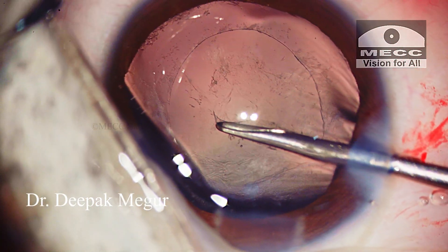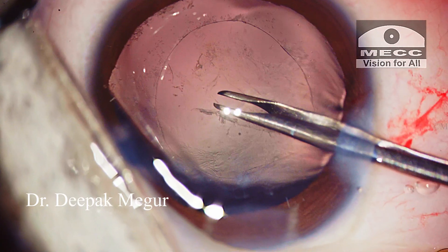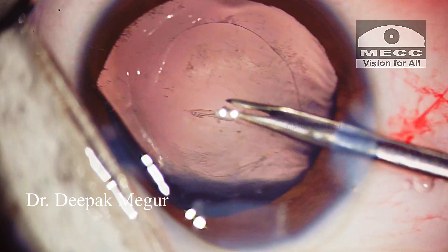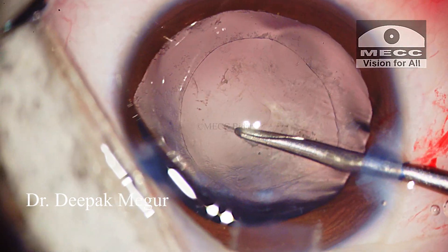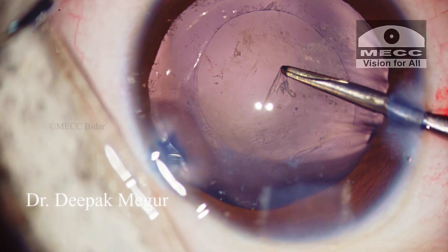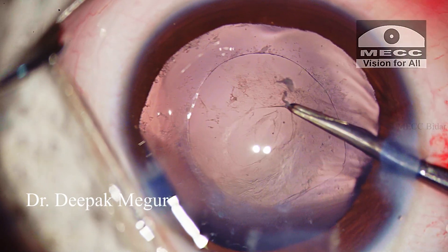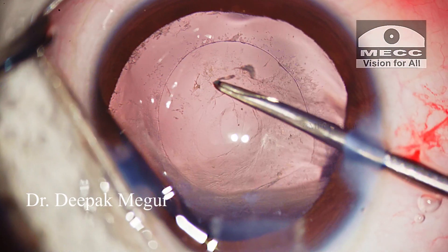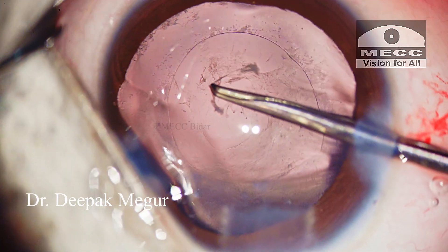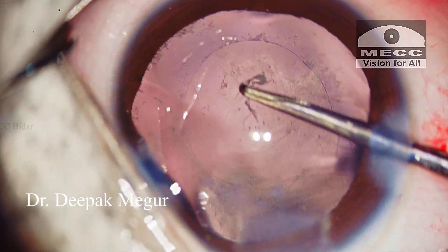The torn edge is held with forceps introduced through the side port. Immediately, I can sense that the capsule is thickened significantly and tearing is not going to be easy. In fact, there is a thin layer of fibrotic plaque also over the posterior capsule. The tearing edge is frequently re-grasped and then a small area is torn and re-grasped again. The rhexis is pretty much in control until I reach a part where there is significant fibrosis, and it takes some effort and persistence until the rhexis could be completed.